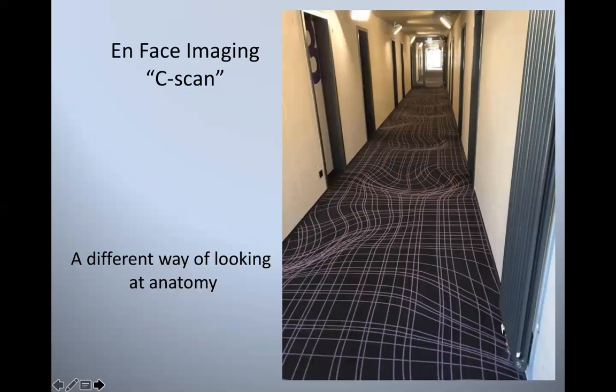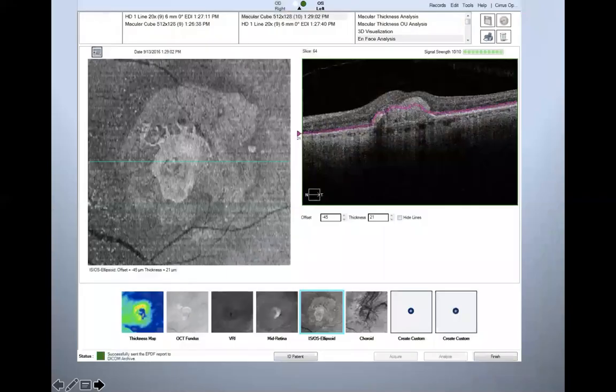We're so used to looking at fluorescein angiography, ICG angiography, and OCT, and our minds are kind of wrapped around that concept. Now we're going to combine the two of them. So it gets a little confusing. Initially, if you're just starting to use OCT angiography in your practice, it can be a little confusing looking at just images and trying to figure out, is that a fluorescein angiogram, or is that an OCT angiogram? But looking en face, as I said, basically means looking on the face of something.